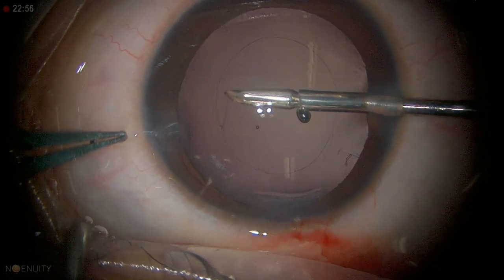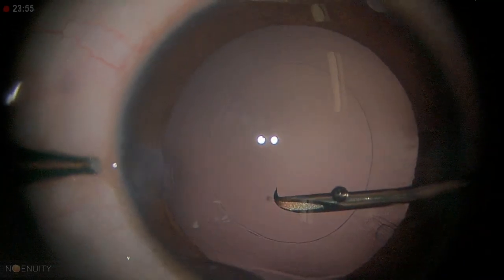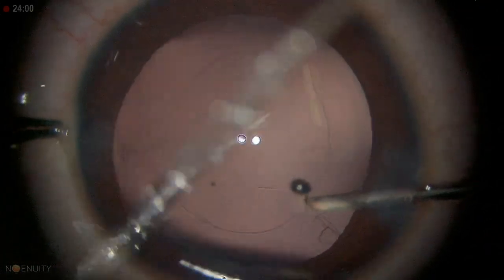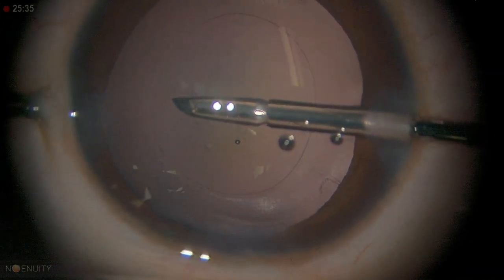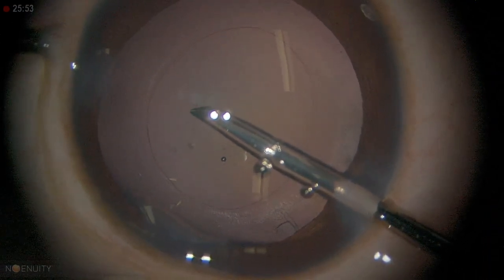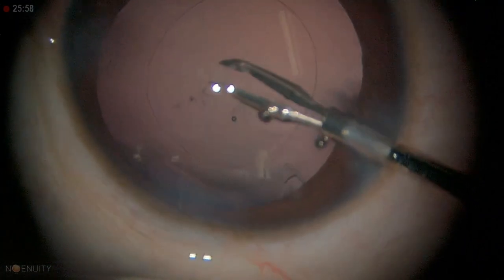Can you see this additional tag? Just make it round. Now we are going to do the posterior capsulotomy. Can you see that nick I made on the posterior capsule? I'm trying to get hold of that capsule. In any patient less than eight years of age I do a primary posterior capsulotomy and vitrectomy. But even in patients who are 12 years old, if they have nystagmus, I definitely do a posterior capsulotomy and vitrectomy.